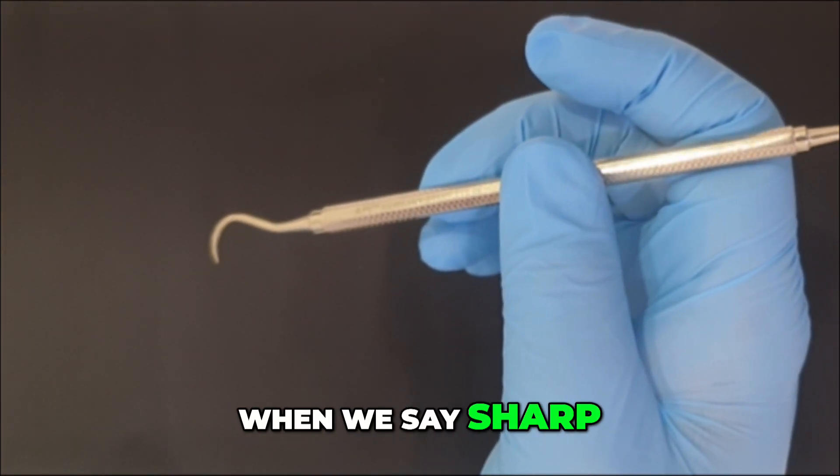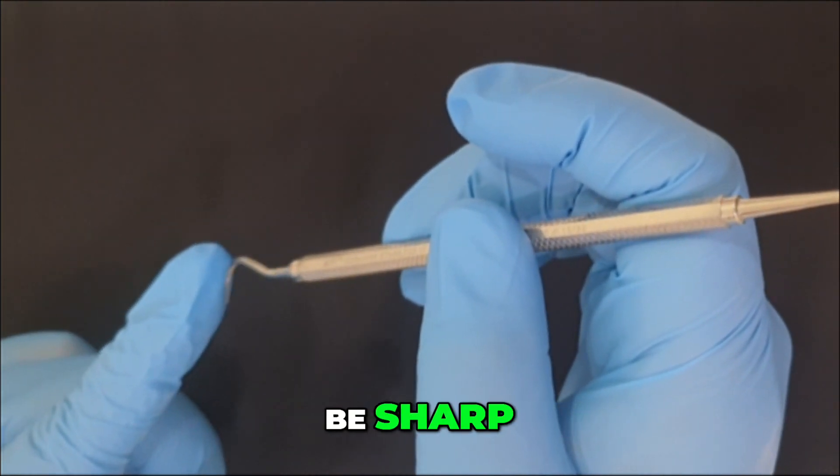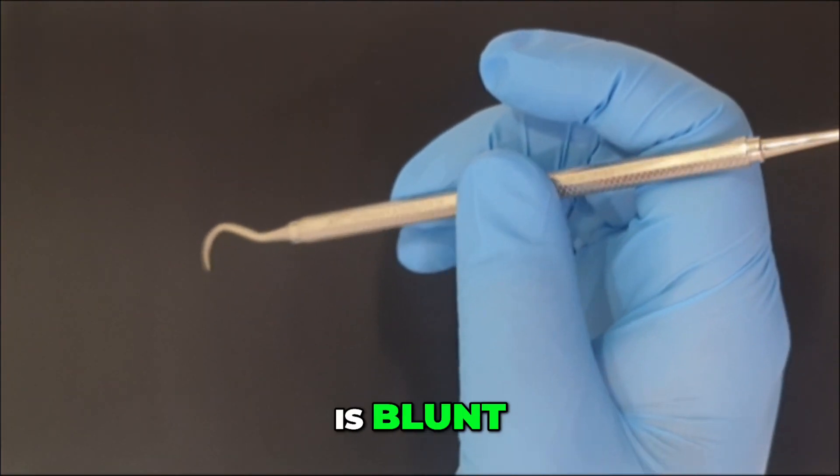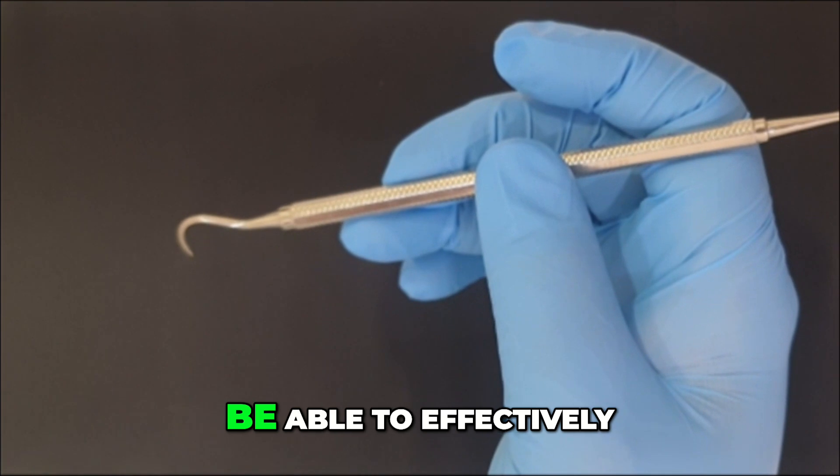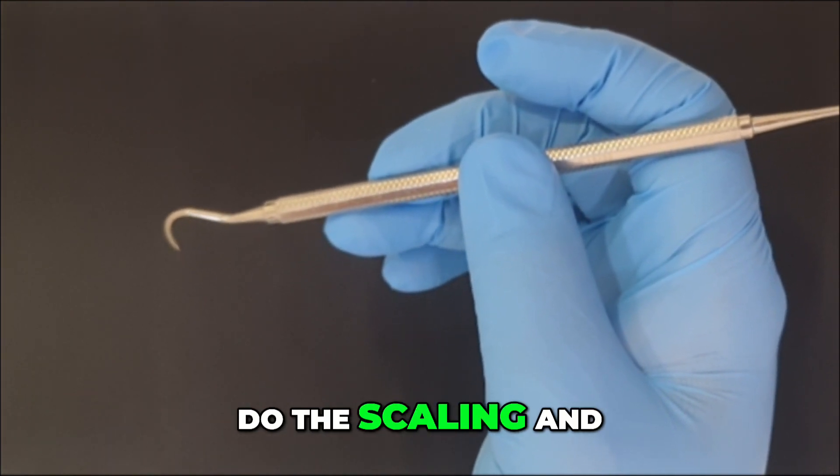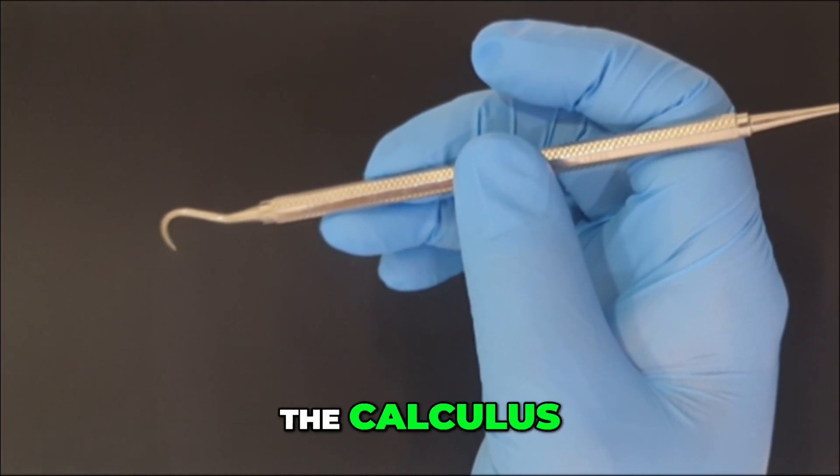When we say sharp, the cutting edge should be sharp. If the cutting edge is blunt, then we will not be able to effectively do the scaling and instead of doing scaling, we will be burnishing the calculus.